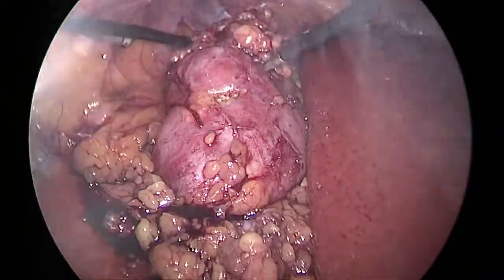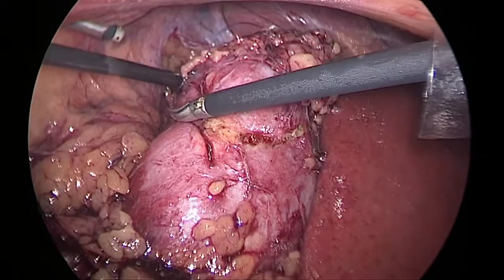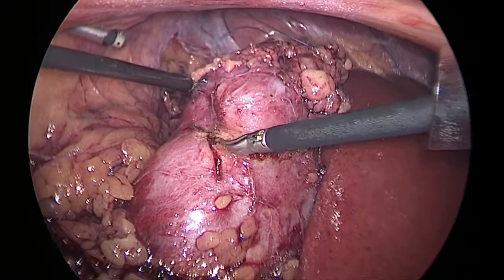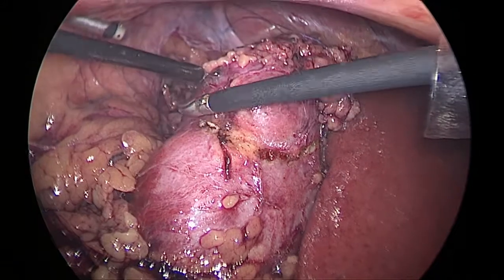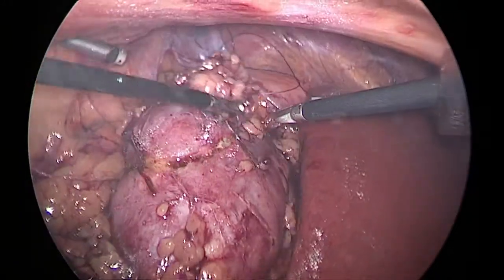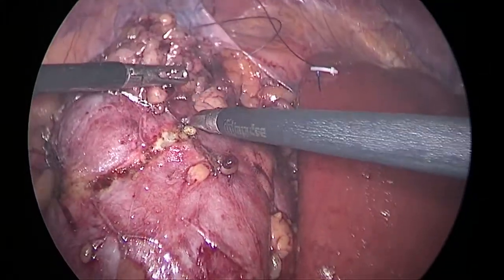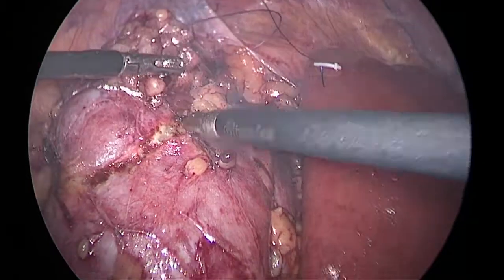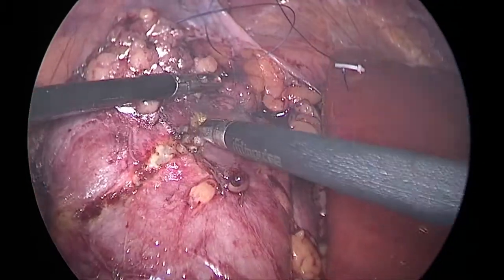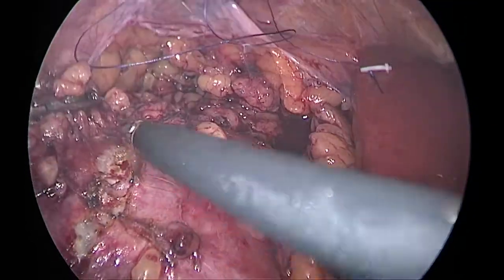You observe that to reduce the ischemia time, I am putting the suture material inside before starting the resection, so that after resection we can immediately start renorrhaphy. I am marking the border of the tumor with the monopolar scissor.